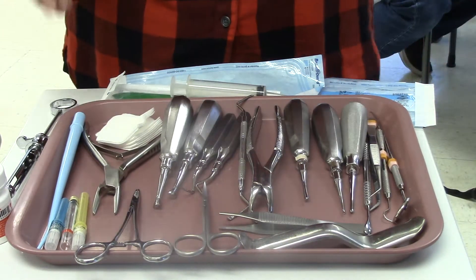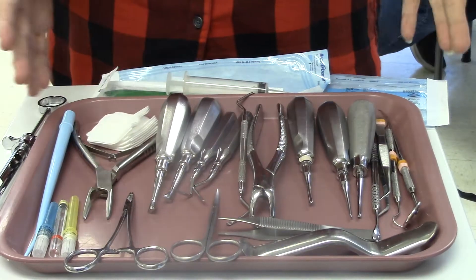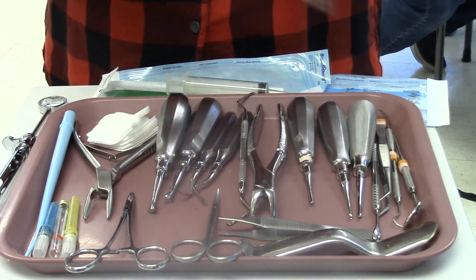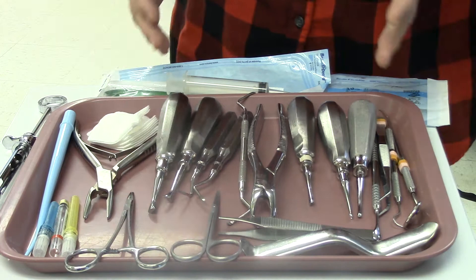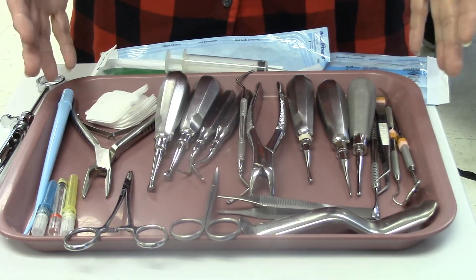This is a surgical tray and you're probably thinking to yourself, wow that's a lot of instruments. It can be much more than this depending on the doctor and exactly what we're doing. So this is kind of a surgical setup but may not apply to every surgical setup.